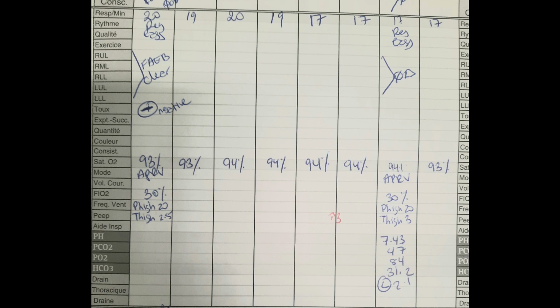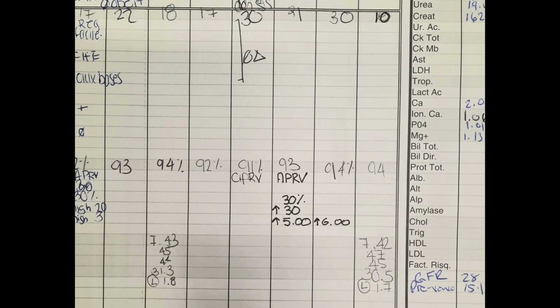So when the APRV was set up, the T-high was initially put at 2.5 and then increased to 3. If you look below, the pH is 7.43 and the CO2 clearance is 47. With the 2.5 T-high, we had a rate of 20, and then after the mandatory releases went to 17, the patient was not breathing above. The patient was not under any heavy sedation. The patient was only on 100 micrograms of fentanyl infusion.